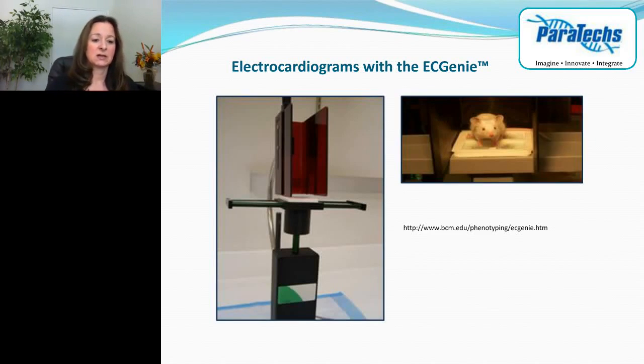Next, we tested cardiac responses to the surgical and non-surgical procedures. We used electrocardiograms, which are recordings of the electrical currents that pass through the heart and signify the activity associated with each heartbeat. The non-invasive EC-Genie instrument from Mouse Specifics was used to record these electrocardiograms from mice without restraint or without any surgical implants. Readings were made by placing the mouse on a sensory pad outfitted with 3 monitoring electrodes. The cardiac activity was measured passively through the paws.